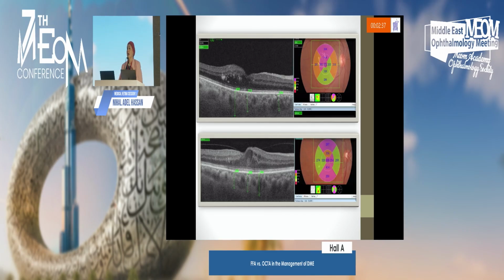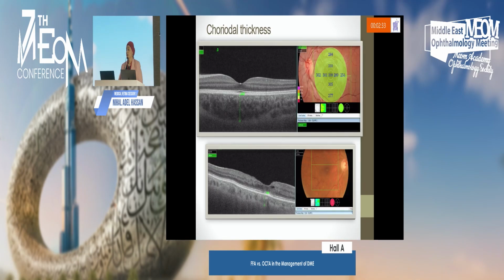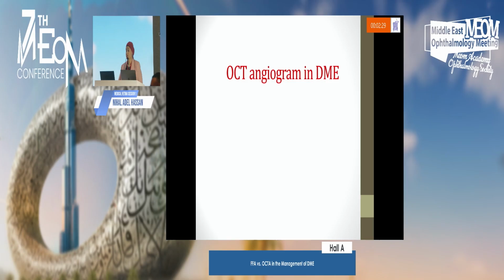All these are additive factors for OCT in cases of macular edema. And of course, the choroidal vascular perfusion factor.